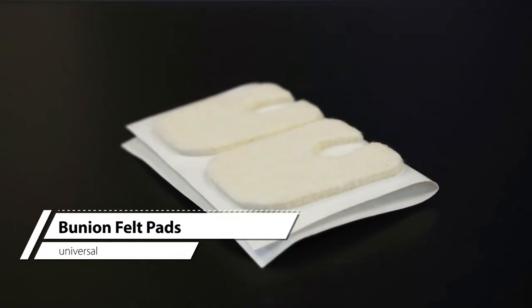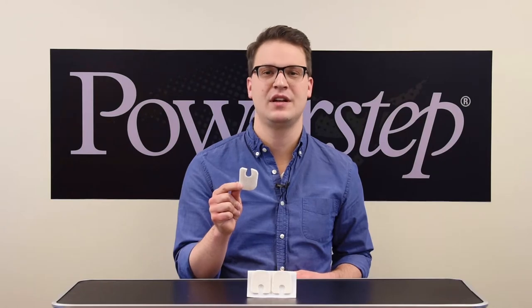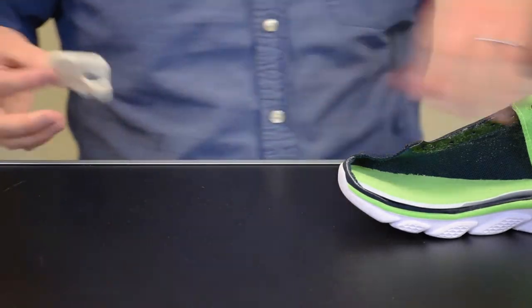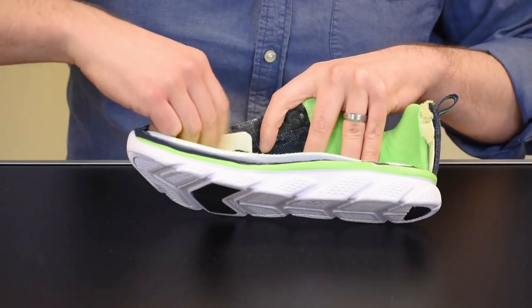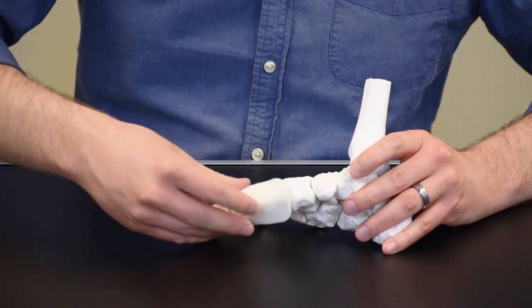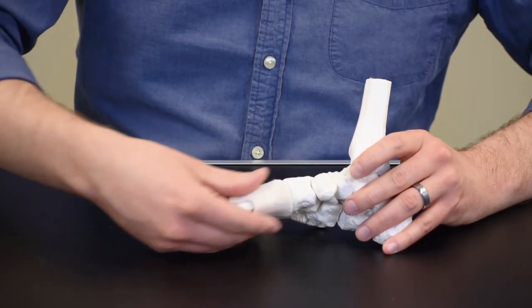Finally, bunion felt pads are used to cushion and offset bunion pressure. These pads are universally shaped and sized. To apply, remove the adhesive backing from the cushion and place in the shoe or on the foot with the affected area positioned in the U-shaped opening of the felt pad. Adjust the position as necessary for comfort.